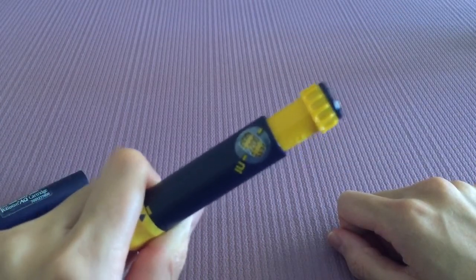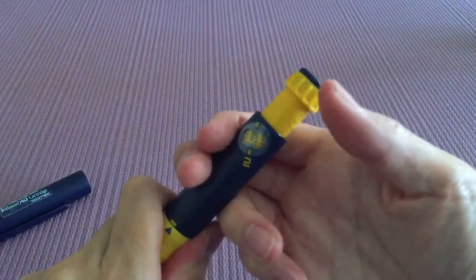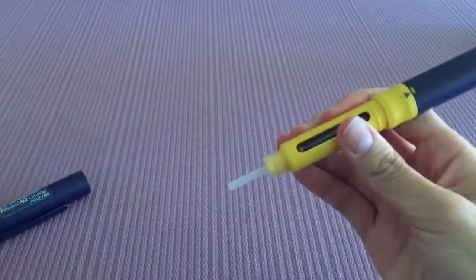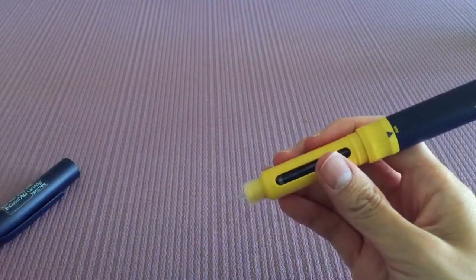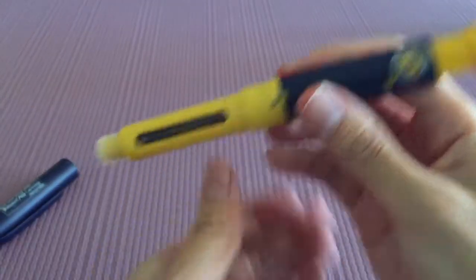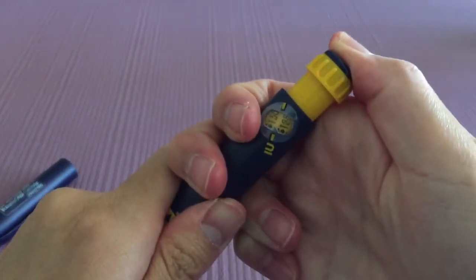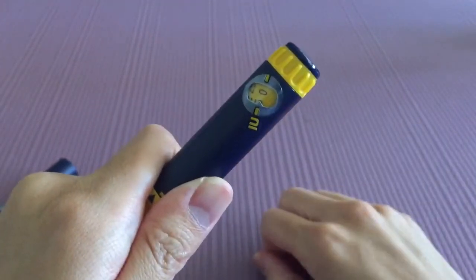To actually administer this medication, all you're going to do is push down on this until it hits zero. Take off the cap — there's another safety needle cover right there. When you're ready, just push this until it hits zero, and then you're done.